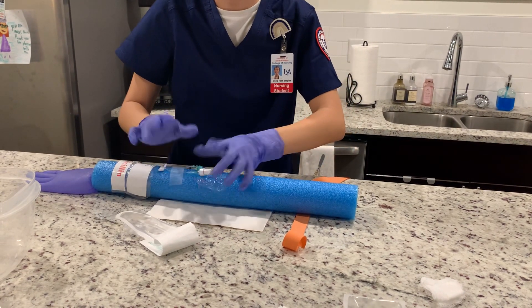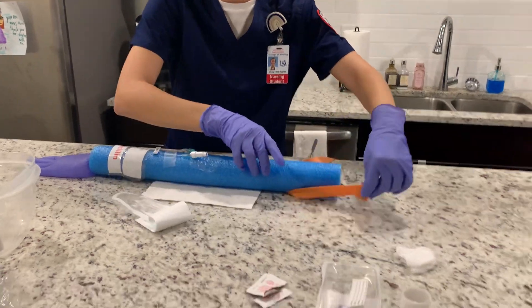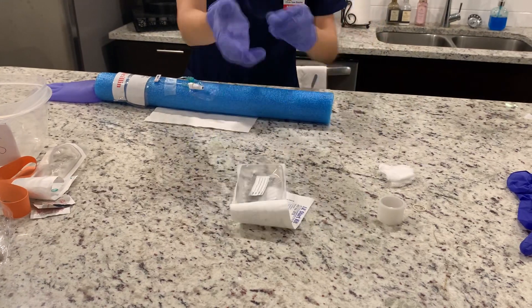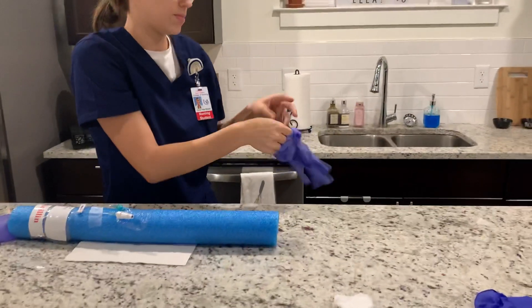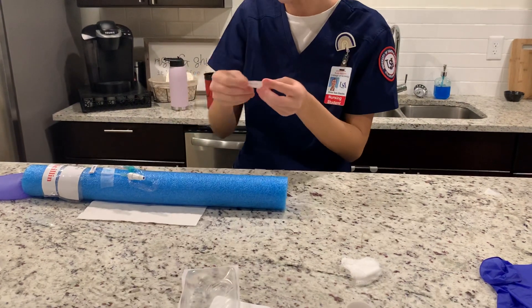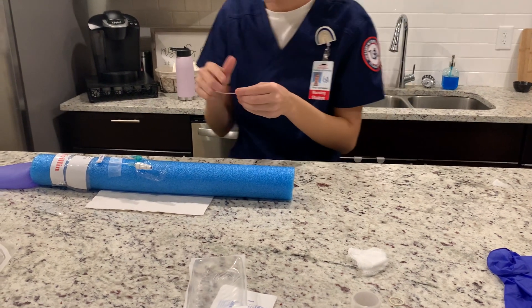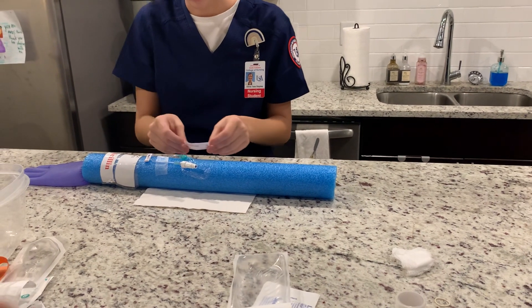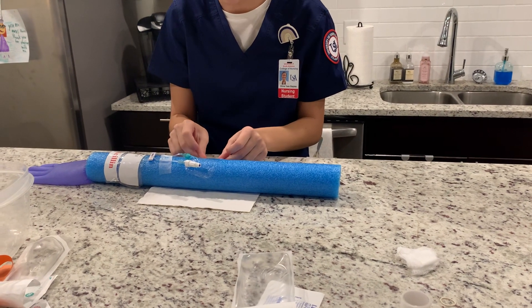Now I'm going to discard all my equipment, remove my gloves, and label the dressing with the date, time, gauge, and my initials, placing the label on the edge of the dressing.